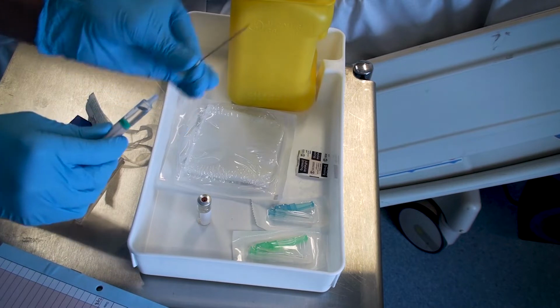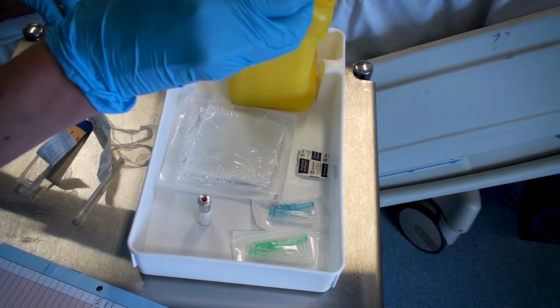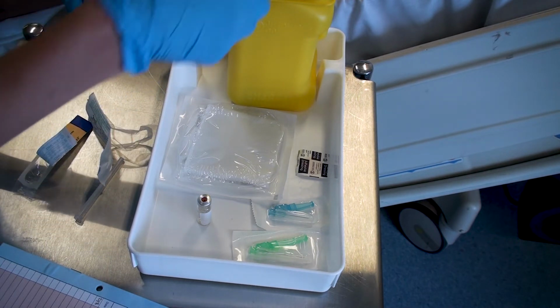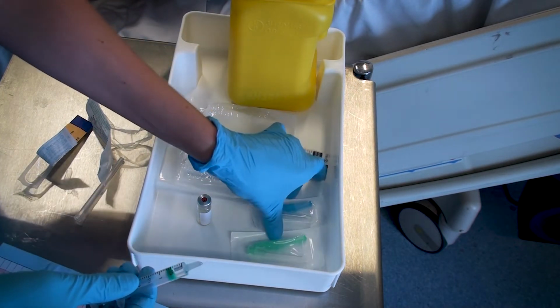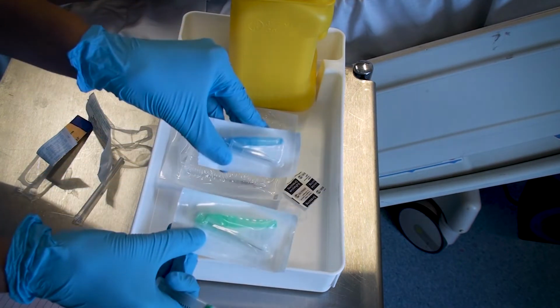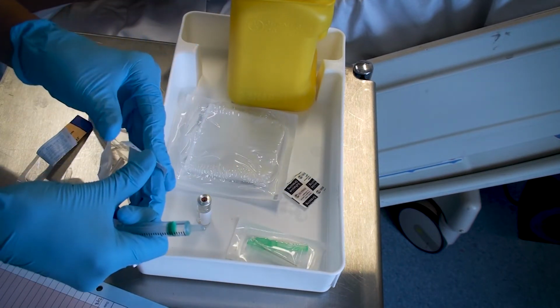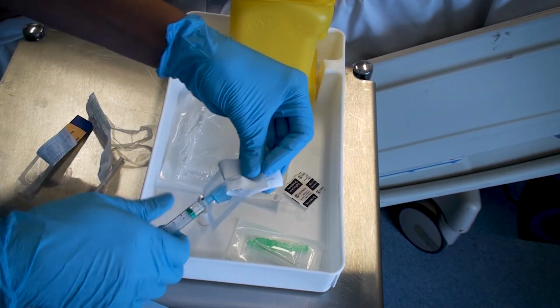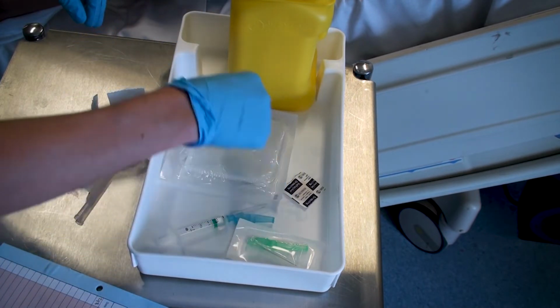Dispose of this drawing up needle prior to attaching the needle that you use to administer the drug to the patient. It can be a blue or a green needle. In this case, we'll use a blue needle. You must then prime the needle prior to administering the drug. Ensure you have all your equipment ready prior to proceeding with this injection.